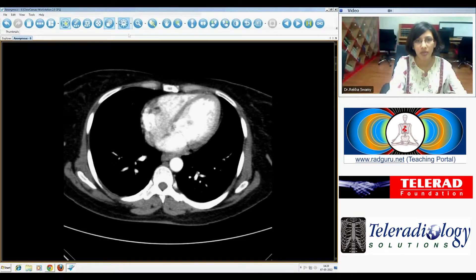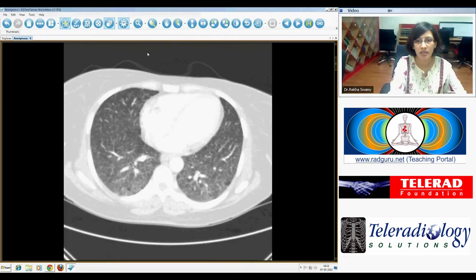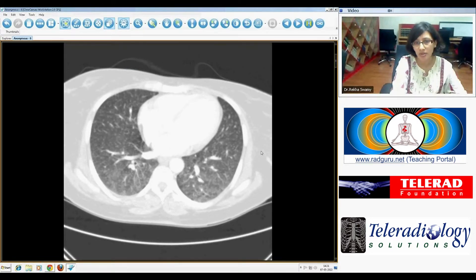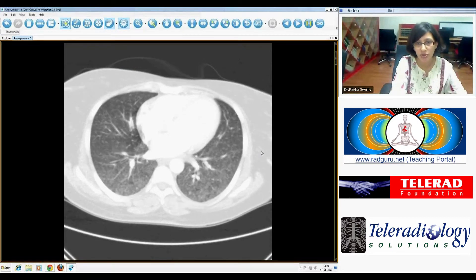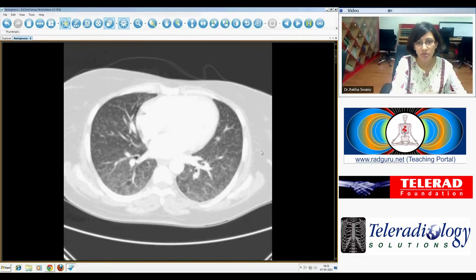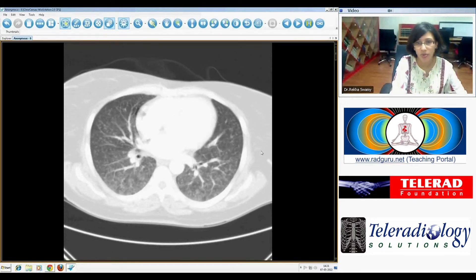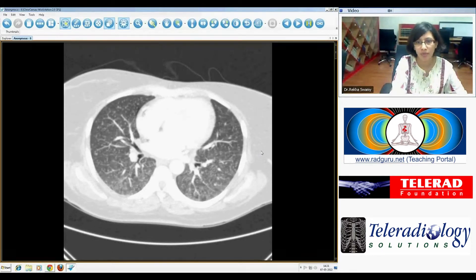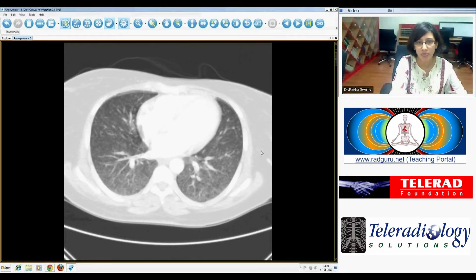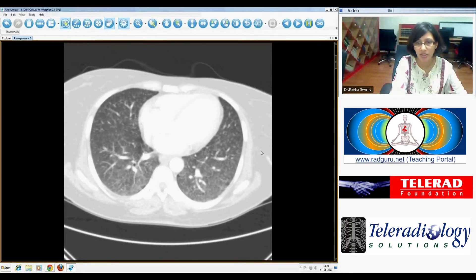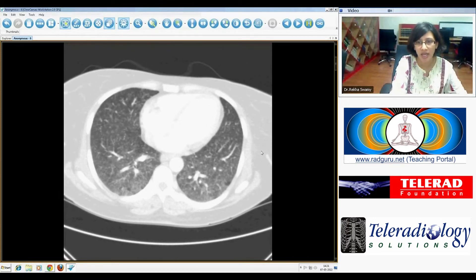Looking at the bases of the lungs, there are multiple tiny pinpoint nodules distributed throughout both lung bases. These are not in any particular pattern — they're just everywhere. These are miliary nodules.